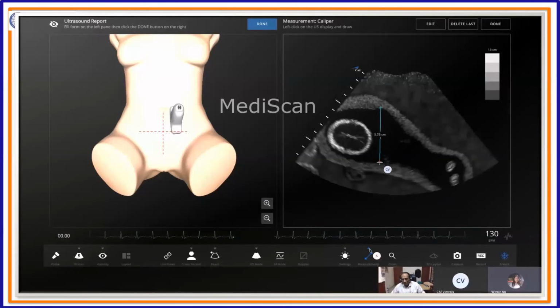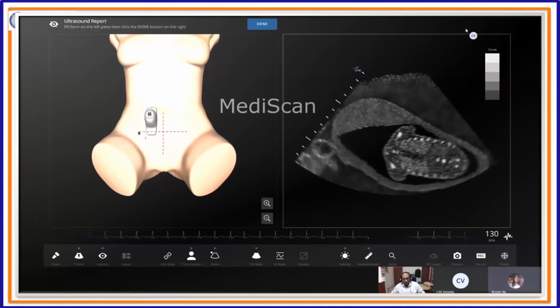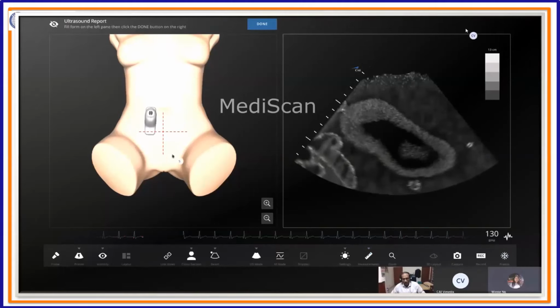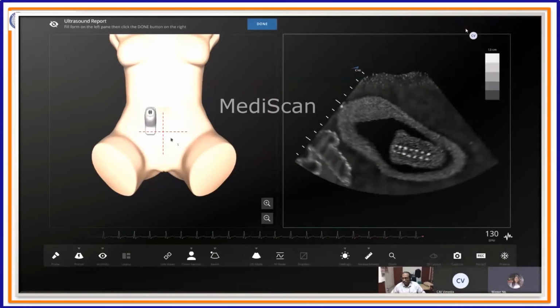However, in the second trimester, we try to measure the single deepest vertical pool, and this holds good even in the third trimester. So that's good. Amniotic fluid is abnormal if the single deepest pool is less than 2 centimeters or more than 8 centimeters. Now you can decrease and go to the last pocket. Before you make an actual measurement, you look all around and look for the deepest vertical pool. Physically looking at it, you can see among all the 4 quadrants that the one we measured, the left quadrant, had the maximum vertical pool.